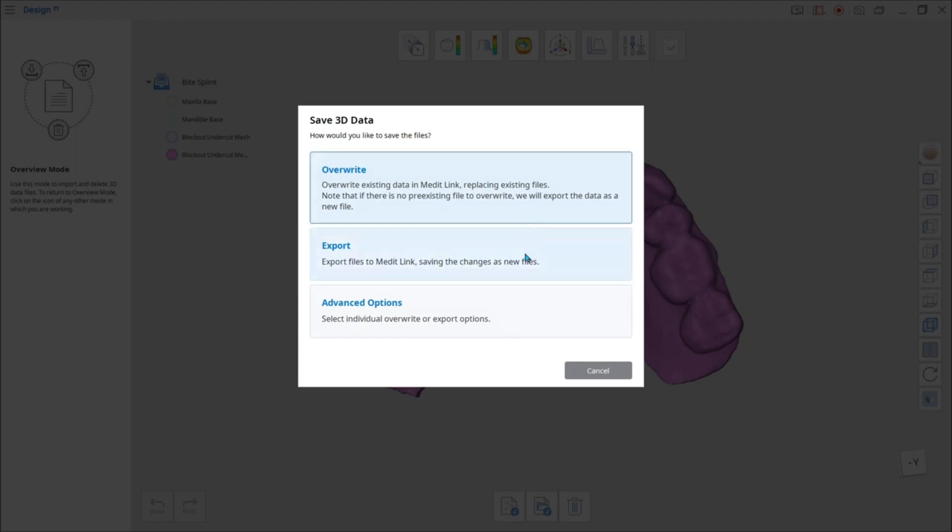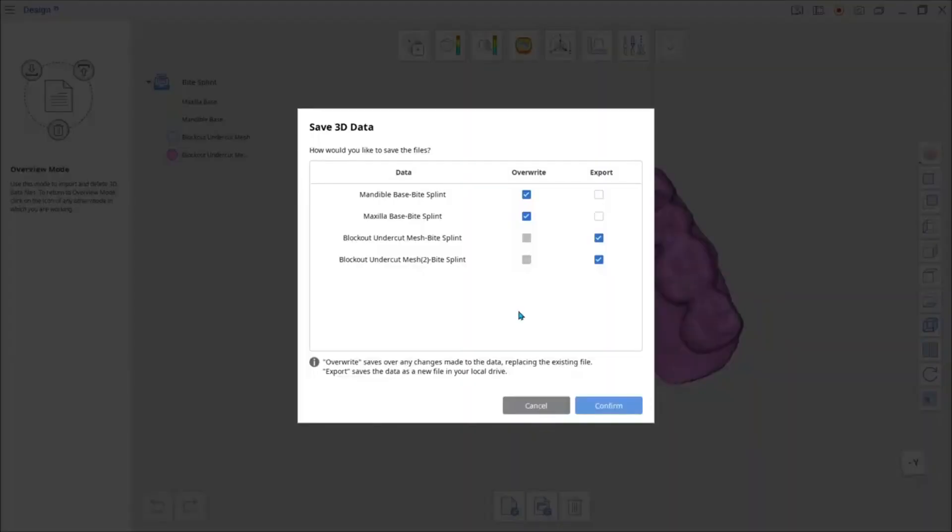Choose Export to save the changes as a separate file. This option allows you to keep both the pre-existing and a new file. If you click Advanced Options in a new dialog window, you can make separate decisions on each file from the data tree.